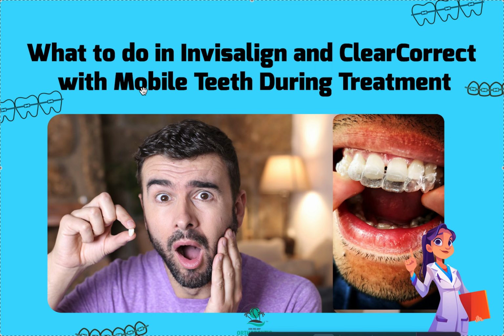I'm going to take them out of occlusion to allow them to stabilize. And we're going to pause the treatment for a little while, or at least pause the treatment in that arch for a little while, depending on what's going on. And then we're going to circle back in about 4 to 8 weeks and see if they tightened up a little bit, take a progress x-ray.